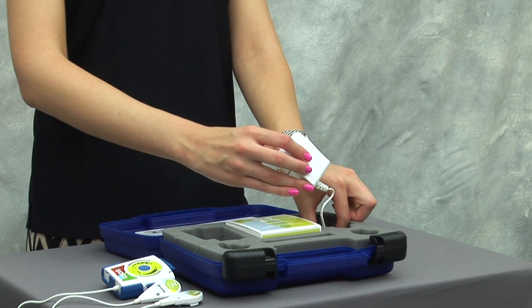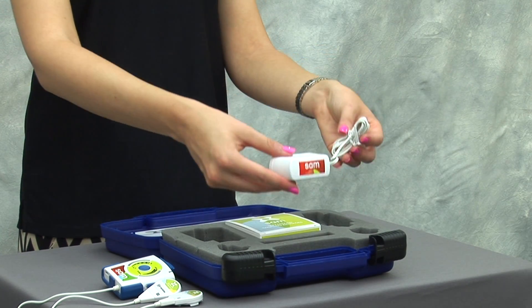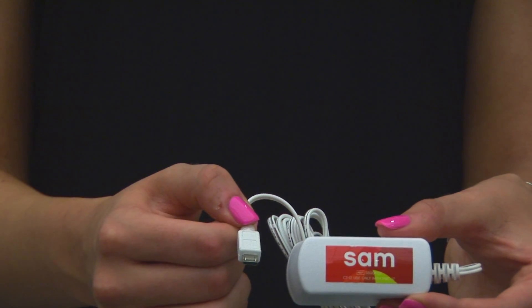The kit also includes a charger to plug the power controller into the wall with a micro USB.